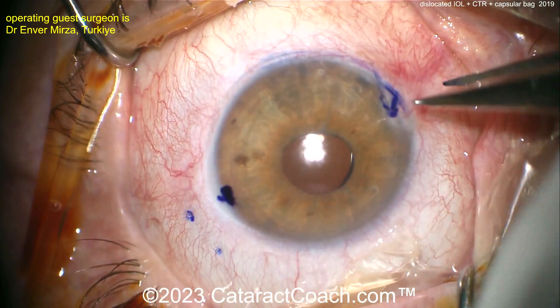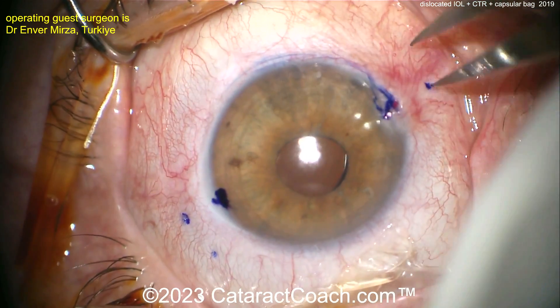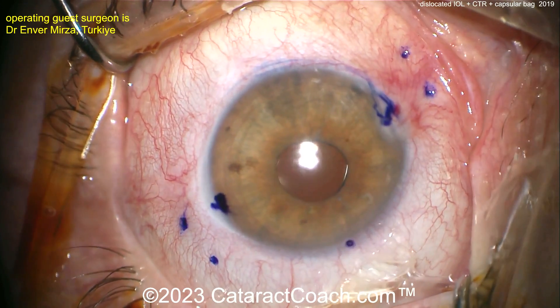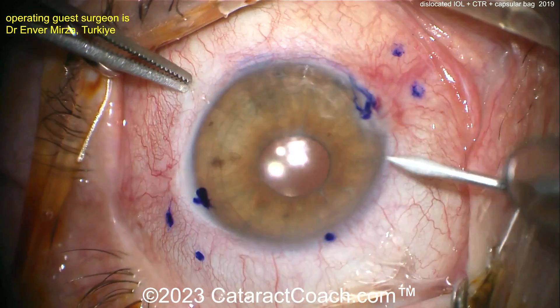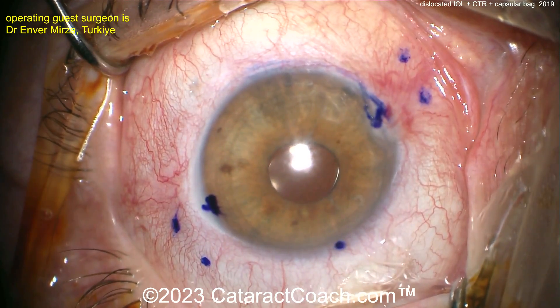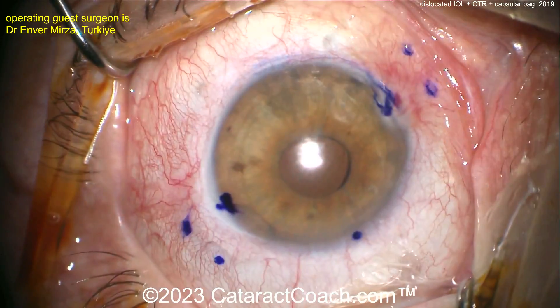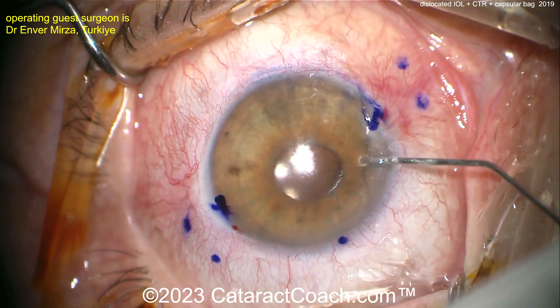Doing the markings 2mm behind the limbus and then 2mm from that — those are going to be the tunnels for the Yamane technique. It looks like the entire lens can be explanted here. There's a paracentesis, and here's another one. It's important to know ahead of time how you're going to explant it.